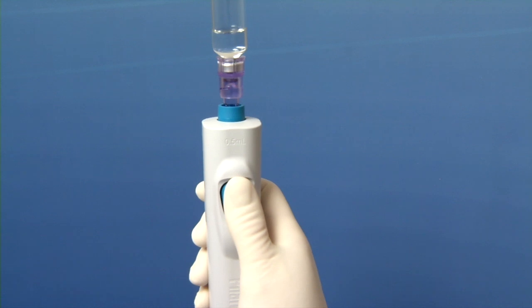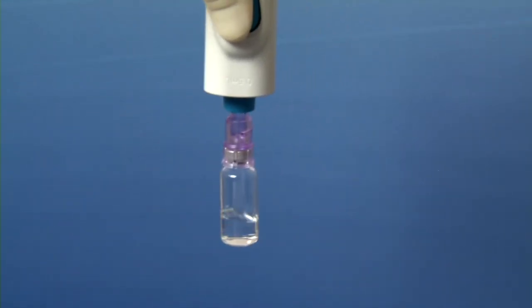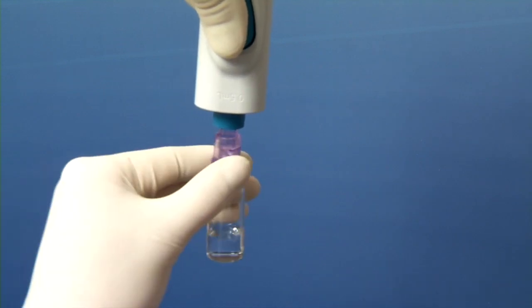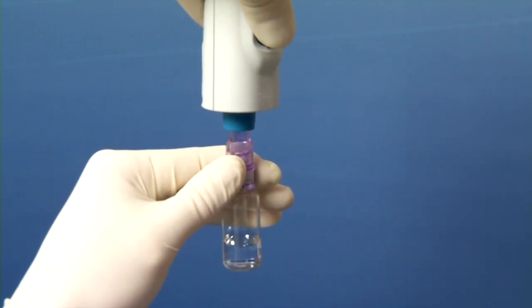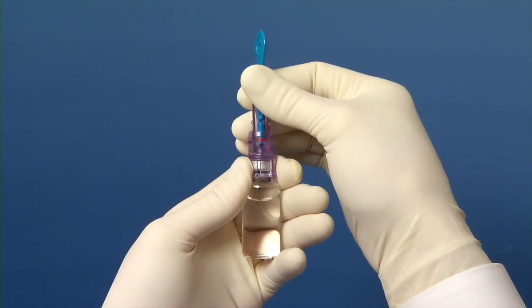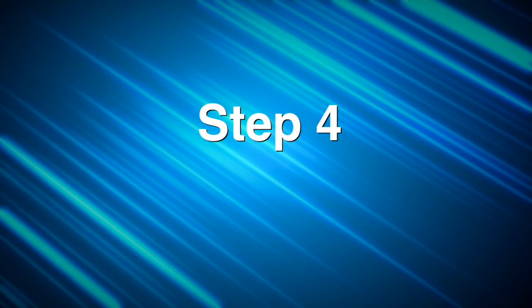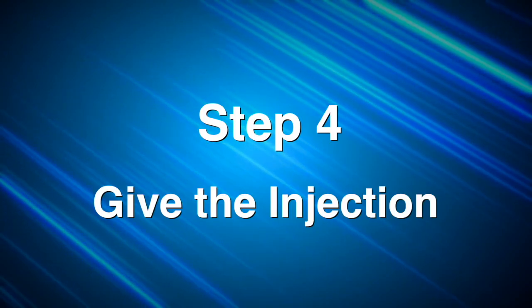Keeping your thumb on the multifunction button, re-invert the assembly so the vaccine vial is now upright. Then remove the syringe and injector assembly from the vial adapter with a counterclockwise turn. If you are using a multi-dose vial, cap the vial by attaching a new syringe into the top of the vial adapter. Step 4. Give the injection.